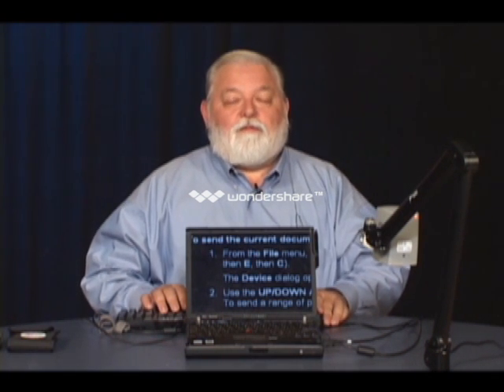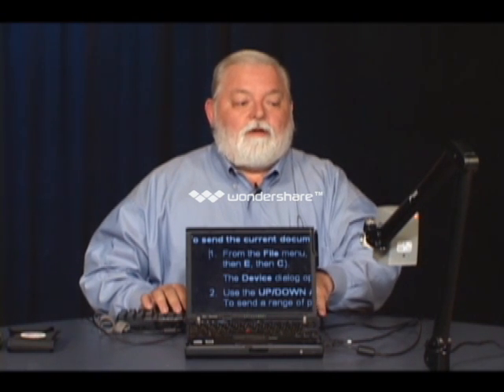Let me ask you this. Is the print now larger than it was? Yeah. I'm running Kurzweil Magic. This system, which I actually don't have to keep running anymore, is the one we use to try to connect our monitor. I'm running about 5 things. I have Kurzweil running here, and I'm reading the manual that I opened up.